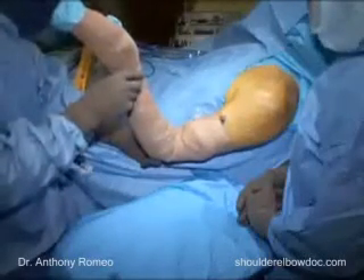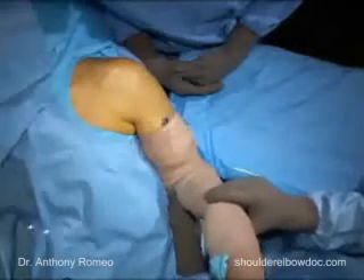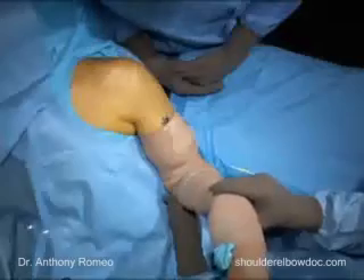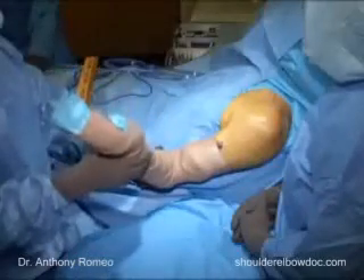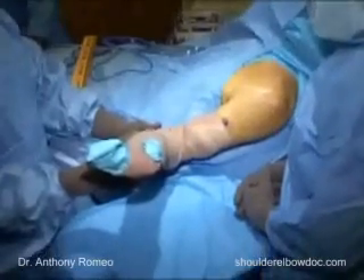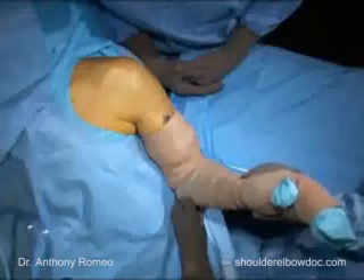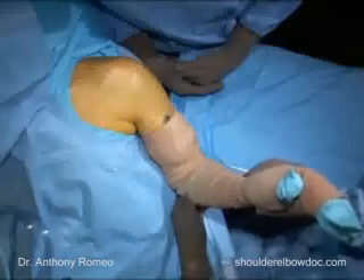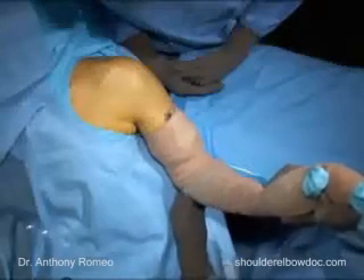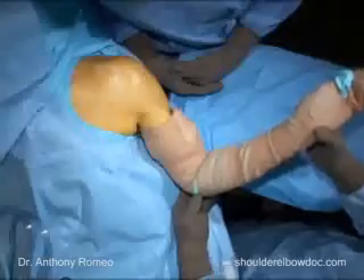When a patient has less than 20 degrees of external rotation, we would typically take our subscapularis directly off of the bone, and that will give us a little bit more room in the subscapularis, allowing us to get close to 50 to 60 degrees of increased external rotation. When the external rotation is more than 20 degrees and we know we're able to get 40 or 50 degrees with our standard approach, we typically will take a trans-tendon approach, which will be demonstrated in this case because of this patient's external rotation.